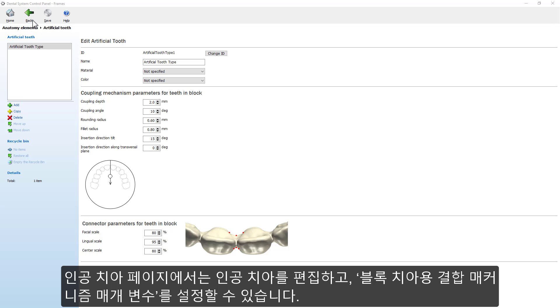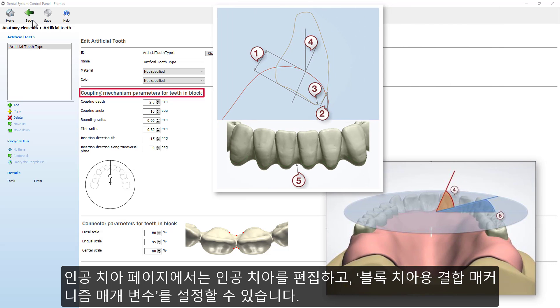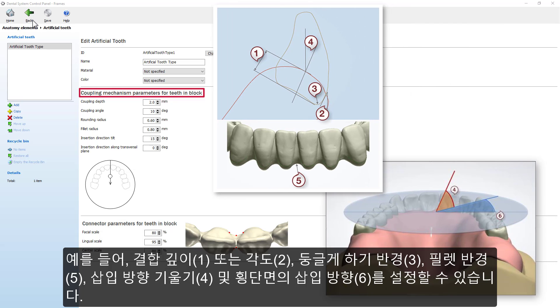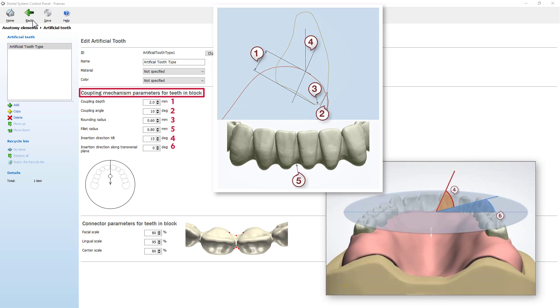This page lets you edit an artificial tooth. Set the Coupling Mechanism parameters for teeth in blocks. For example, set the Coupling Depth, Angle, Rounding Radius, Fillet Radius, the Insertion Direction Tilt, and the Insertion Direction along the Transversal Plane.